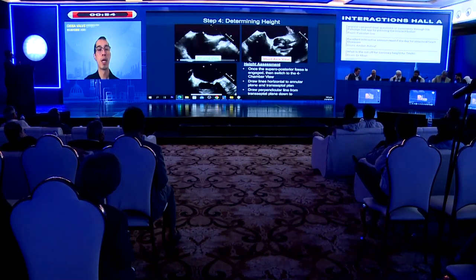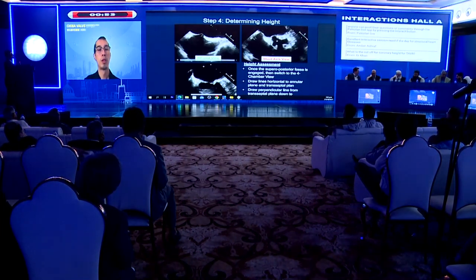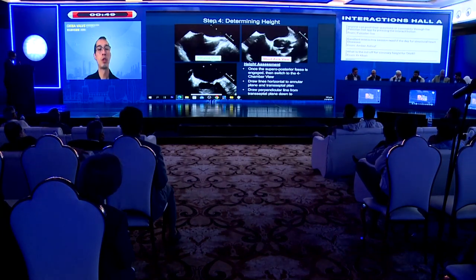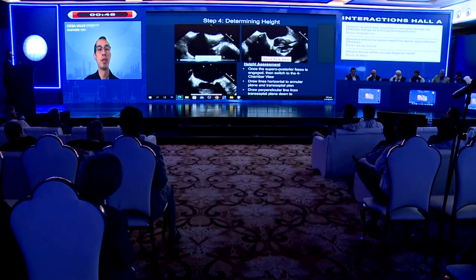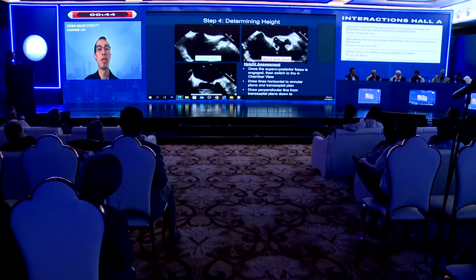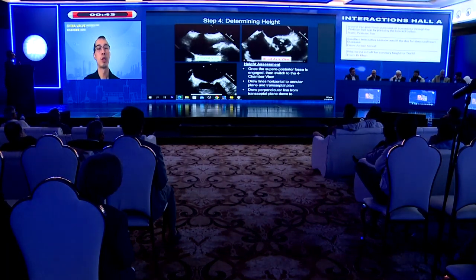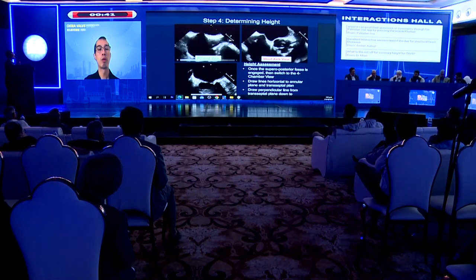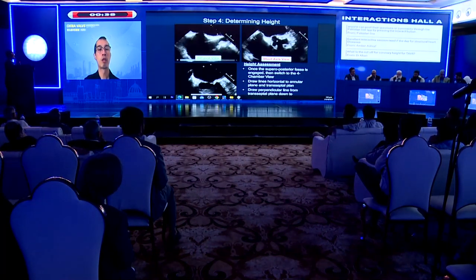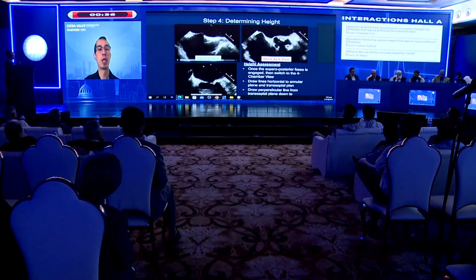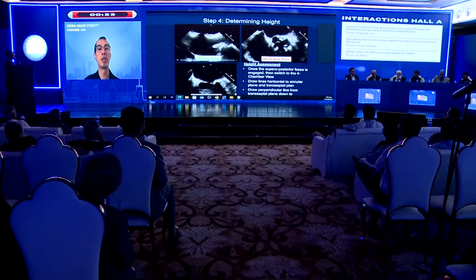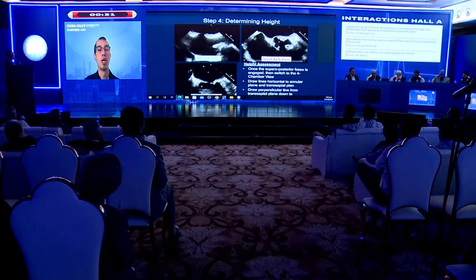On the bicaval view, tenting is visualized. Biplane imaging is then used simultaneously to see how posterior the needle is — the image is flipped for real-time guidance. The echo operator sweeps the cursor to the left until the needle drops, allowing both planes to be seen simultaneously. Height is then measured by drawing parallel lines across the tenting point to the mitral annular plane.